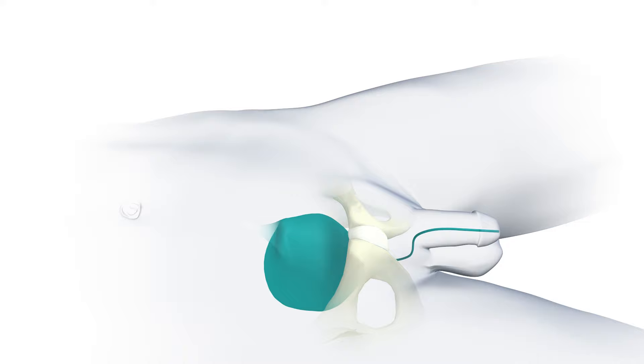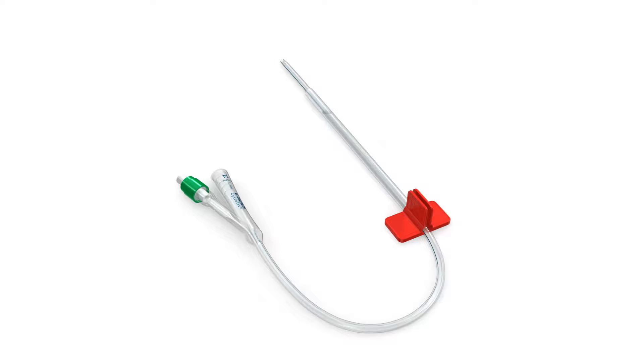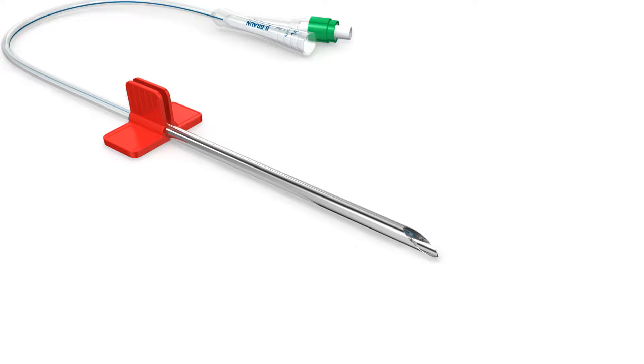Then make a small incision with the scalpel on the skin at the target area for easier penetration of the puncture cannula. Systofix is ready to use as the catheter is pre-inserted into the puncture cannula. The catheter is retracted into the cannula to ensure the adequate distance from the sharp-edged tip. Then the protective sheath is removed.